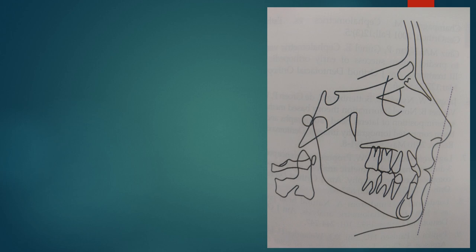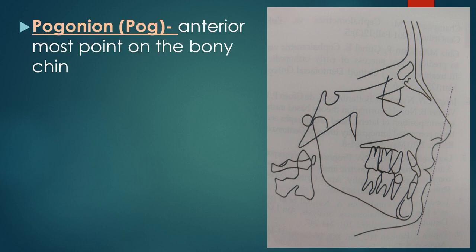Pogonion. Pogonion is represented as POG. It is the anterior most point on the bony chin and is present here. Represented as POG.